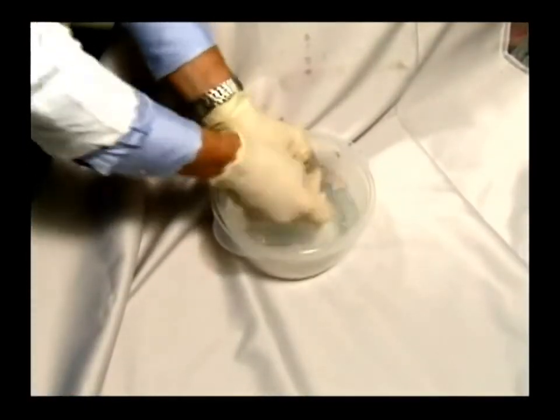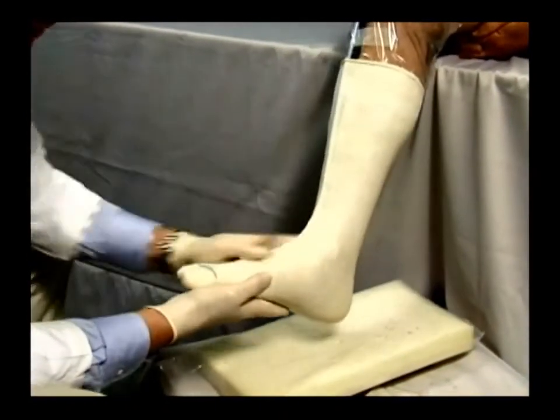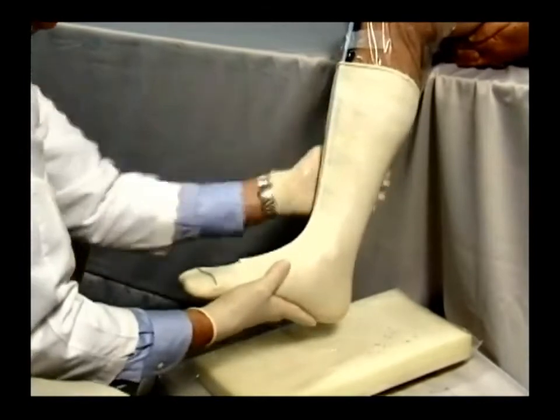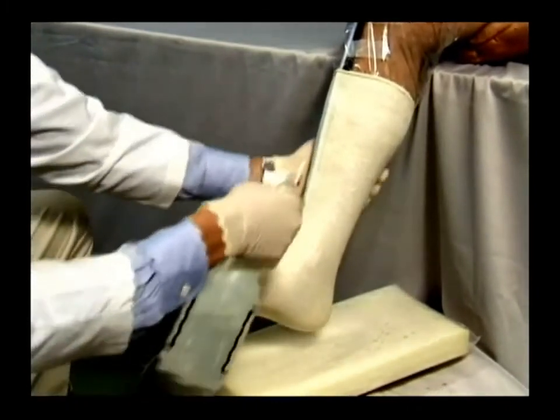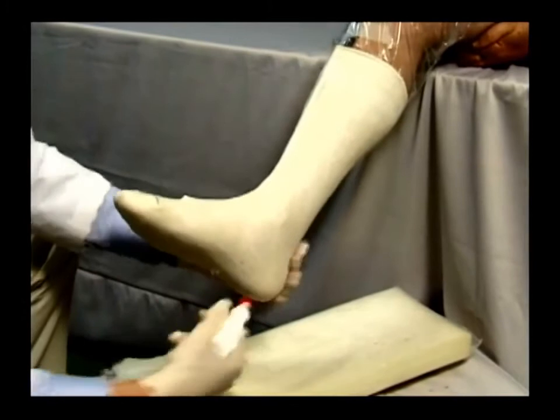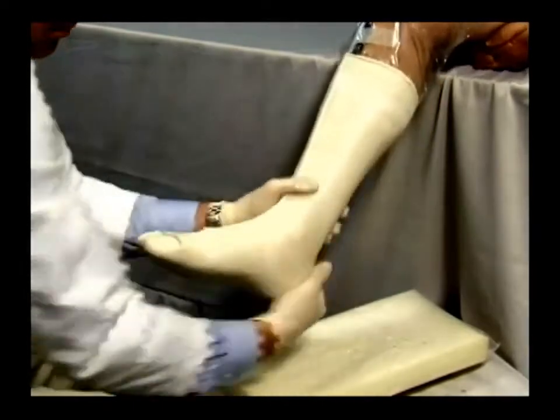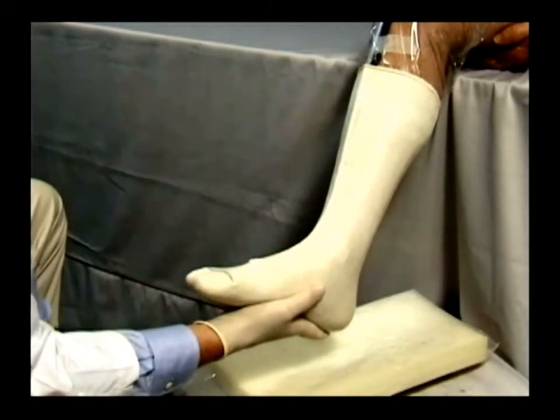After making the scissor cut, immediately dip your gloves in water and commence massaging and rubbing the sock resin into the fabric. Always work from distal, the toe end, to proximal, the open end. If the resin begins to feel sticky or tacky, it means more water is needed on the surface. Use a fine mist spray bottle to spray a thin film of water over the entire surface of the sock — front, back, bottom and sides. Continue wetting your gloves and spraying the sock surface until the entire sock feels slippery during the molding and massaging process. Unlike plaster, it is impossible to use too much water with the STS sock. Water will not thin out or weaken the resin, so when in doubt, add more water.